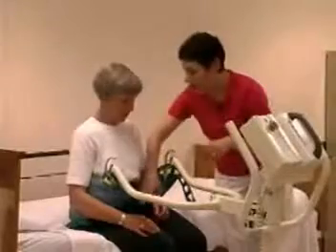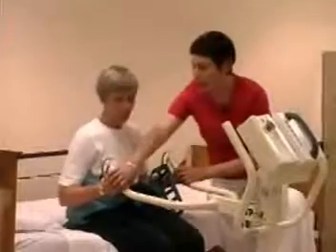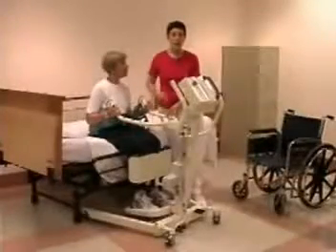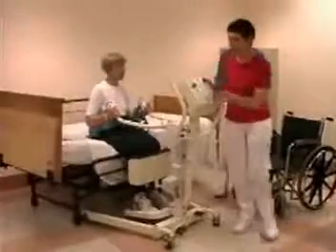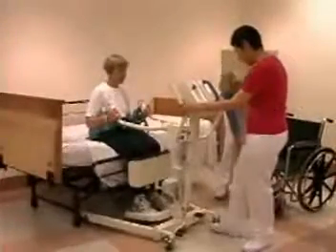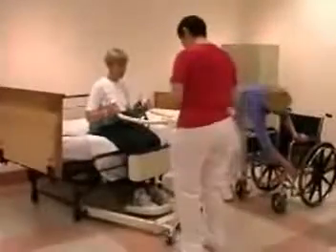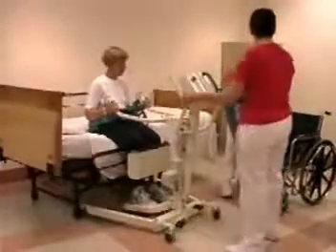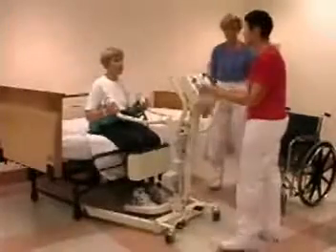Okay. Now I'm going to have you put your arms on the outside of the sling and hold on to the lifting arms. I'm going to move around to the controls as our second person joins us to guide Mrs. Johnson into the wheelchair. We're going to unlock the base. And meanwhile, our second person has locked the wheelchair so that we're sure that the wheelchair isn't going to slide while we're doing the lift.